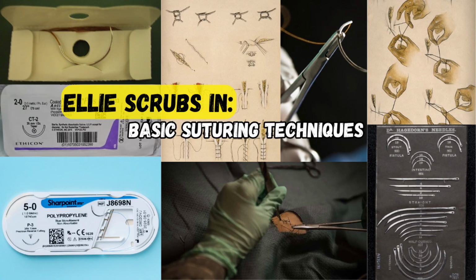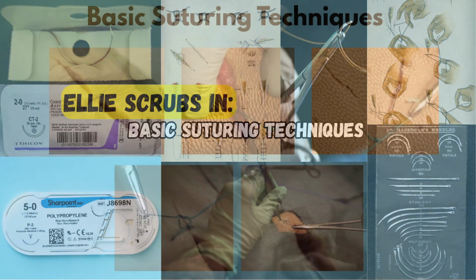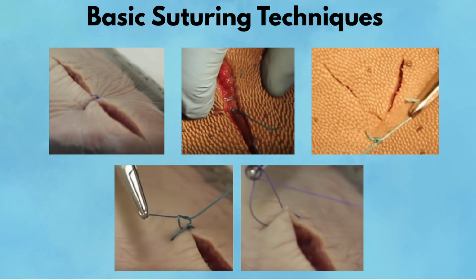This video is a practical, step-by-step walkthrough of the foundational suturing skills that show up everywhere. How needle angle controls eversion and inversion. How to place a simple interrupted stitch. How to bury a knot with an inverted dermal stitch. How to protect a corner with a corner stitch. How to control tension with a slip knot. And how to evert and support edges with a vertical mattress.